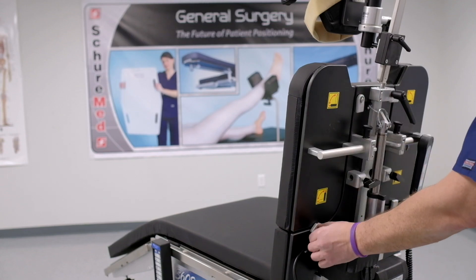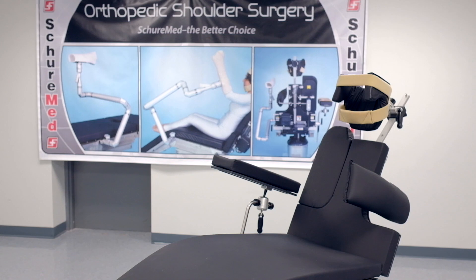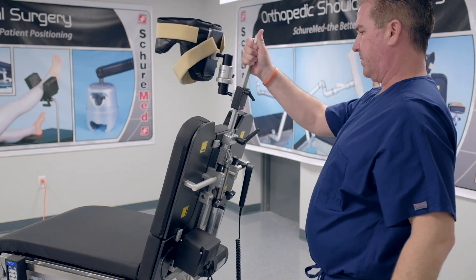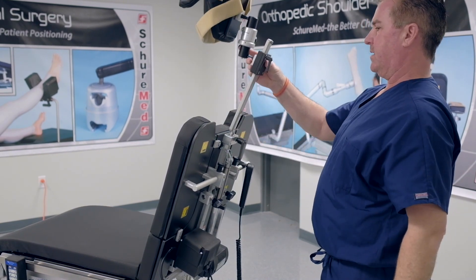Our shoulder pull-away panels provide excellent surgical exposure, and our product comes standard with our 5-piece deluxe pad set and lateral brace. Our double-ball jointed head position system safely secures the patient's head, allowing it to tilt 30 degrees in every direction.